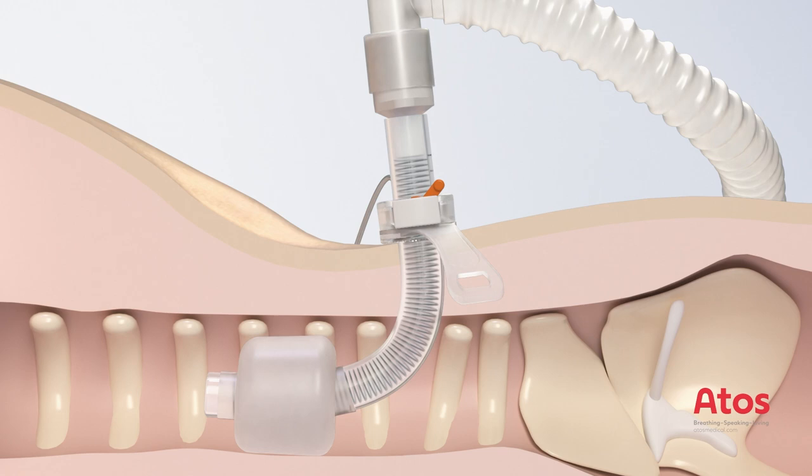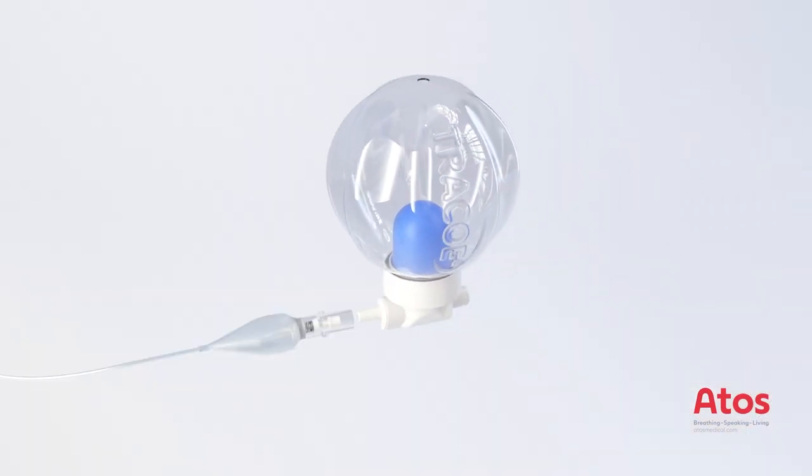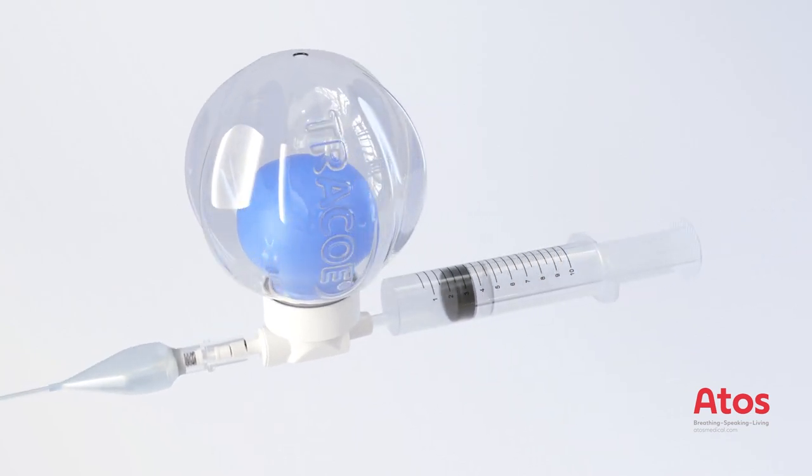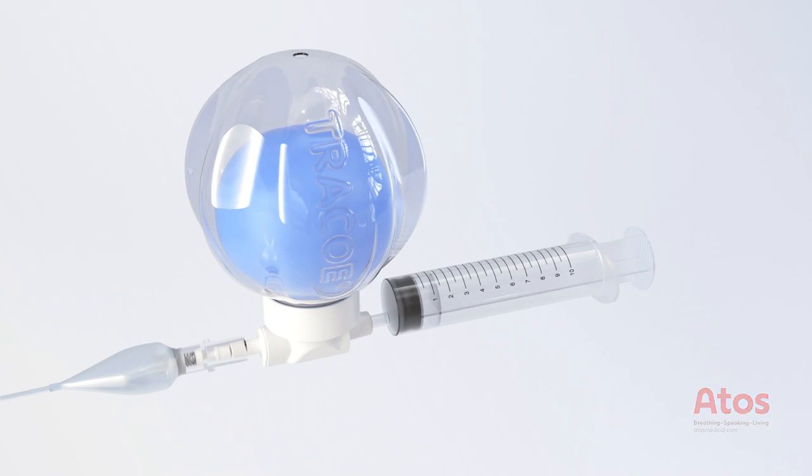The cuff pressure should be between 20 and 30 cm of water. Alternatively, the Traco Smart Cuff Manager can be connected for continuous monitoring and regulation of the recommended cuff pressure.